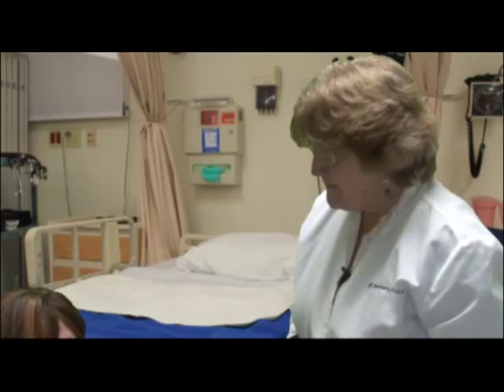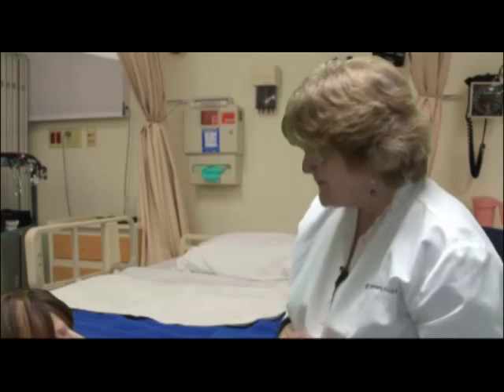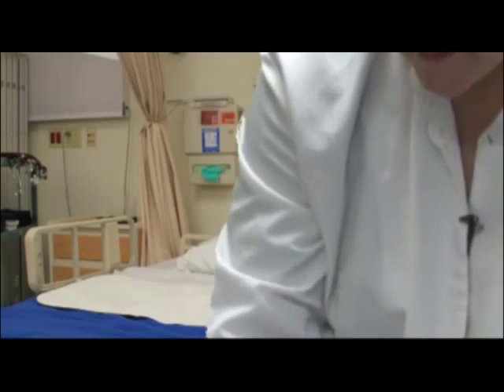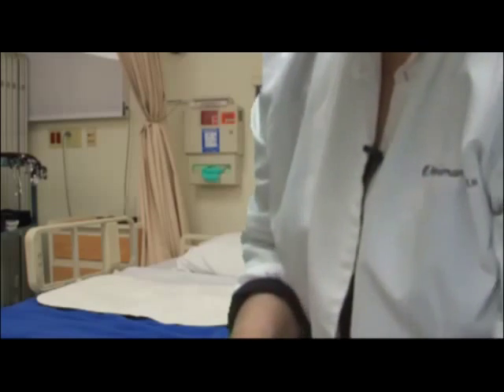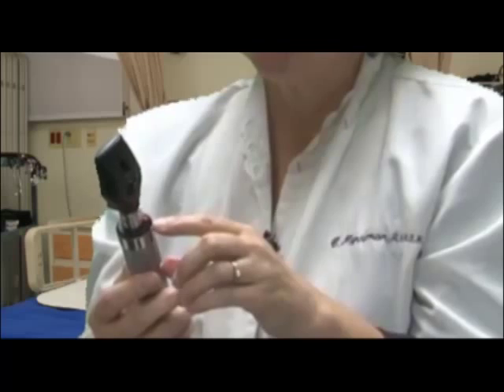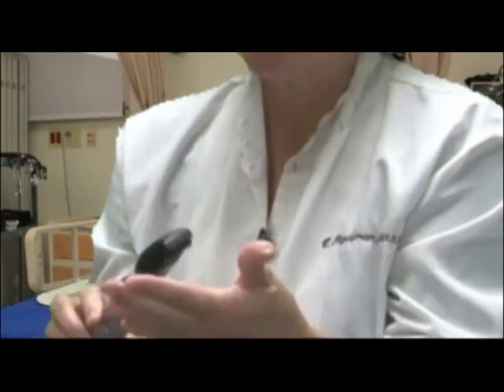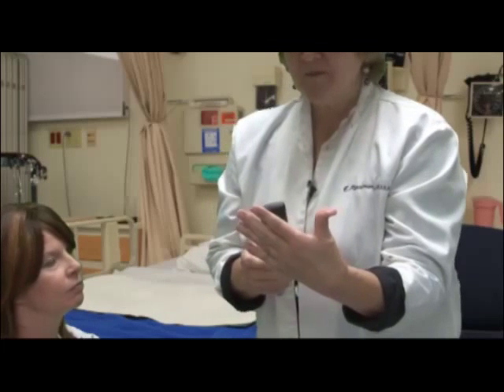All right, now, Lita, what I'd like to do is I would like to look in your eyes and your ears and your mouth, okay? So to do this, students, again, you can take an ophthalmoscope off the wall, but I have to put mine together. So I use this base, and what I'm going to do is I think I'm going to go ahead and use the ophthalmoscope head, and you actually have to kind of screw it on. In my clinic in pediatrics, you actually have to put together this stuff. And then there's a little red button that turns a cam around, and that should just turn that light right on.